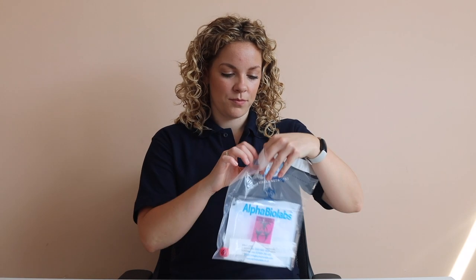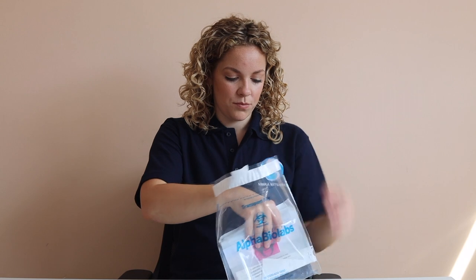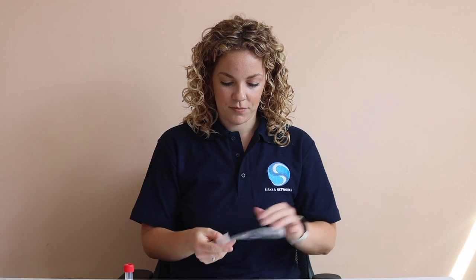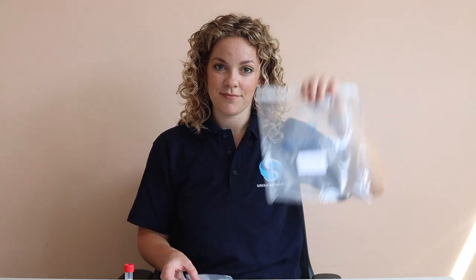You may now open your test kit. Lay out all of the items in the kit on a clean surface in front of you. You should have a throat and nasal swab in sterile packaging, a test tube containing a small amount of liquid, a biohazard bag, the clear transport bag your kit came in, and a track 24 return envelope.